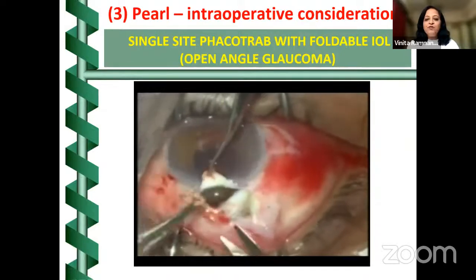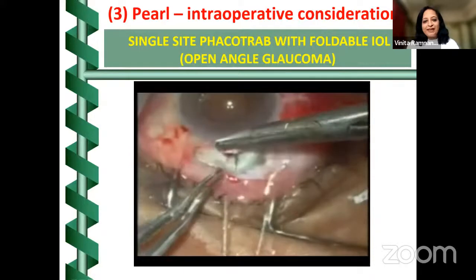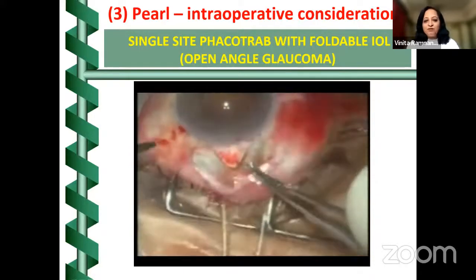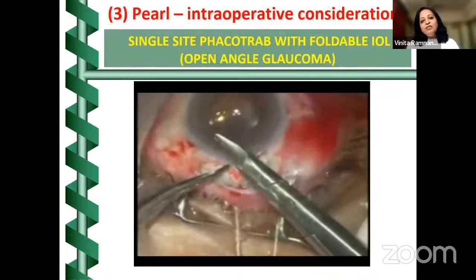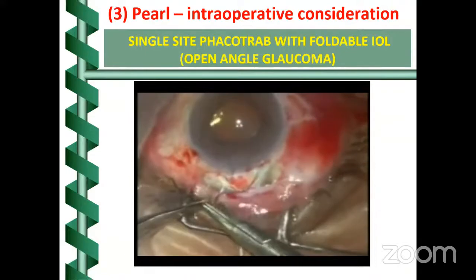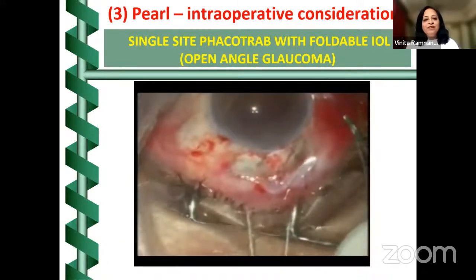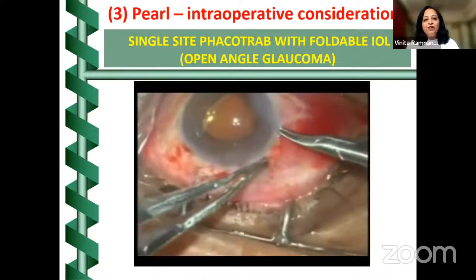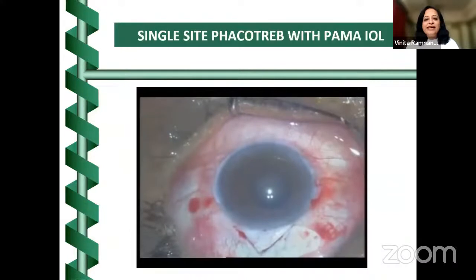This inner window is 1.5 by 2 millimeters. Then you do a broad iridectomy and put a suture, one at the apex with 10-0 nylon. Depending upon the surgeon's preference, one can put only one suture, that's okay, but we can put 3 sutures also. One of them could be releasable, and at the end you can put an angle anchoring suture. So it is to be done in any variety.